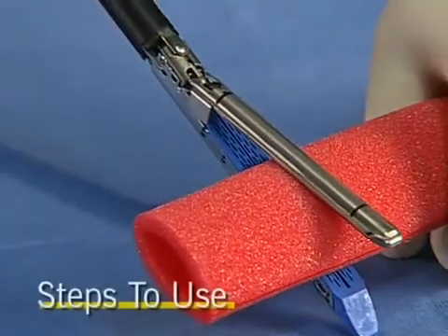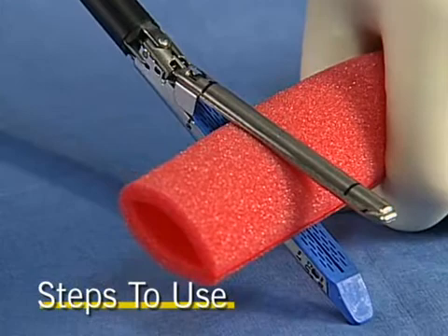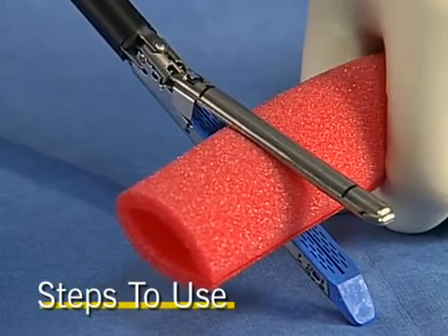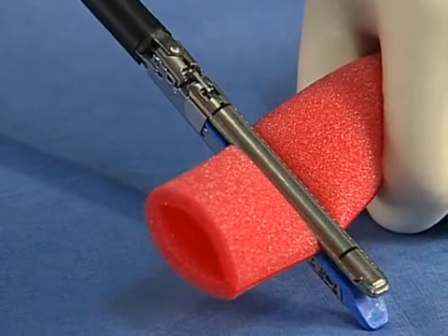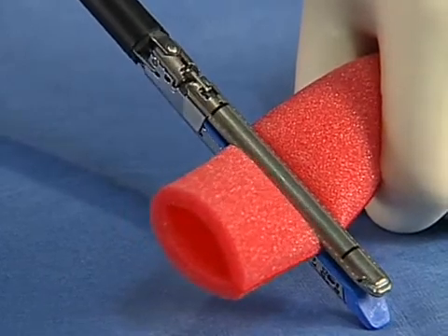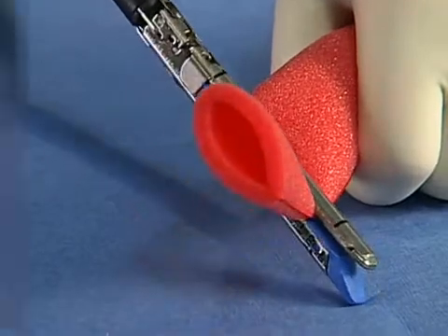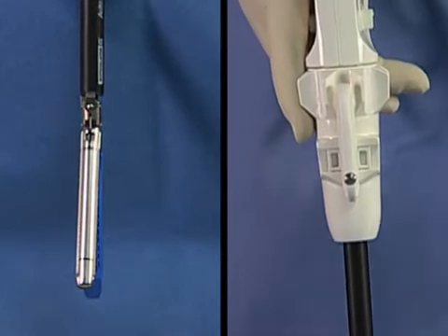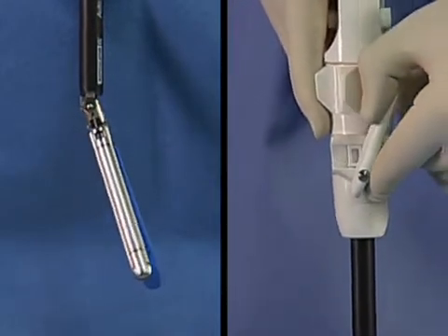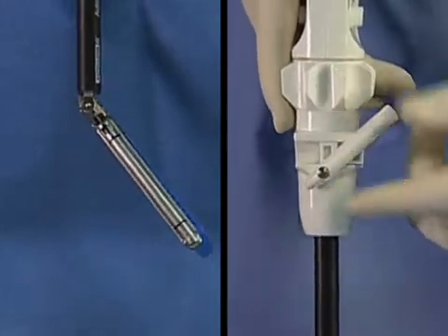Steps to use. Apply the EndoGIA Universal Stapler across the tissue that is to be transected and squeeze the ring handle completely to close the jaws. Assure that no extraneous tissue or obstructions such as clips are in the jaws. When using a reticulator loading unit, the articulation lever may be used to lock the loading unit at either 22 or 45 degrees in either direction.